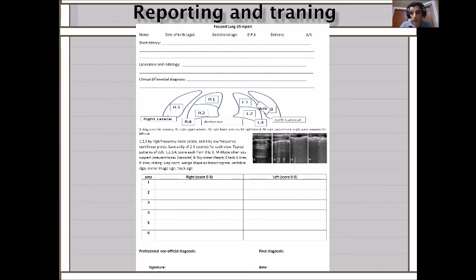Very beautiful picture of diagnosing kerosene. Then you can decide to send the baby home. I don't know whether you guys have kerosene poisoning or not, but they use it, very easy. It's very common in India.